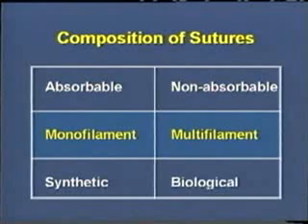Multifilament sutures consist of several filaments or strands, twisted or braided together. This affords greater tensile strength, pliability, and flexibility. Multifilament sutures may also be coated to help them pass relatively smoothly through tissue, enhance handling characteristics, and minimize the risks associated with bacterial growth within the strand. Coated multifilament sutures are well suited to intestinal procedures.